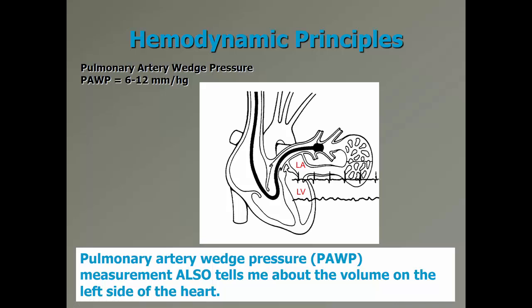And therefore, because there are potential complications, there are some hospital systems that will not allow nurses to wedge a balloon. If the physician wants the pulmonary artery wedge pressure, they've got to trot on up to the unit and measure it themselves. Is it a better pressure measurement? Yes, it's a little bit more accurate than the PAD.